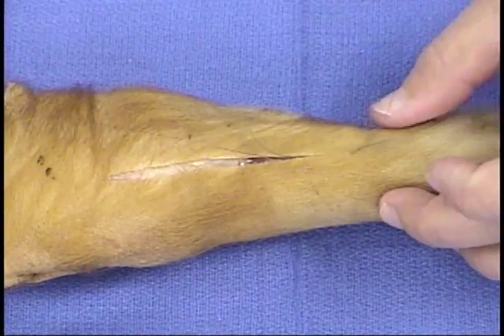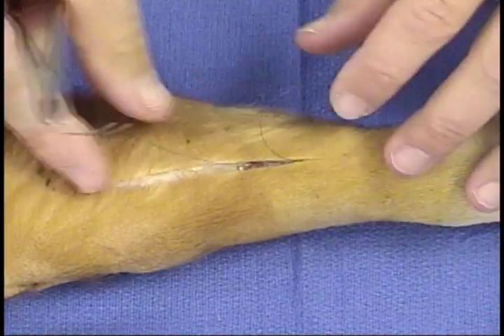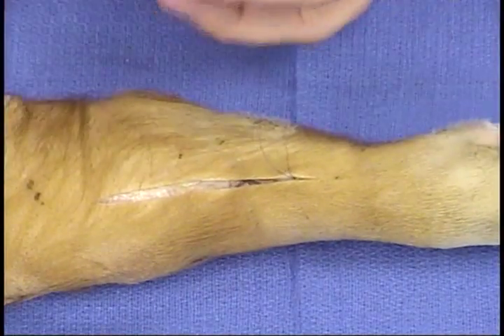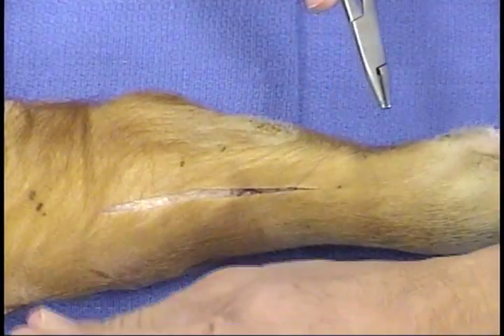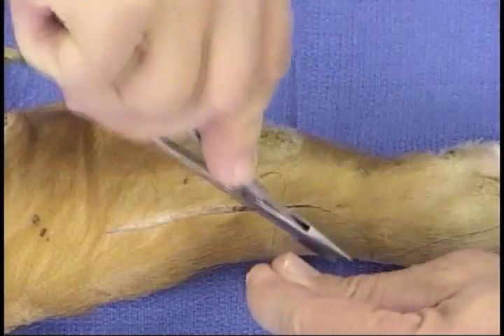Pull the suture through so that the loop of suture goes back underneath the skin, and that you have grasped a piece of tissue that will allow the knot to remain secure, yet will be buried well underneath the skin.